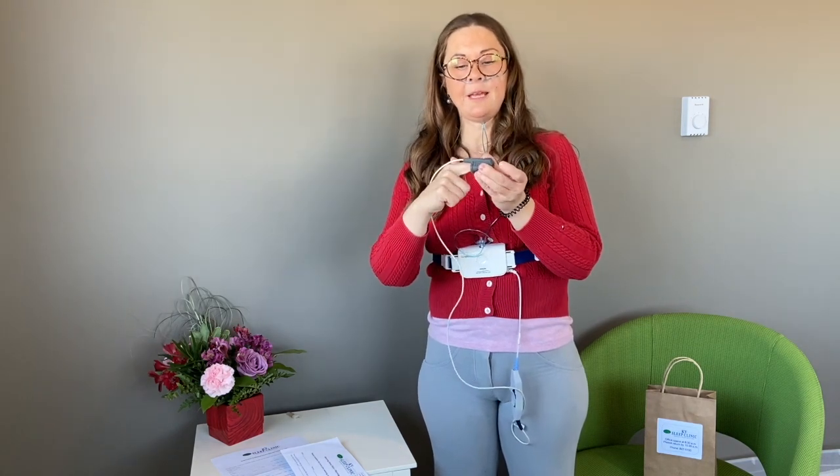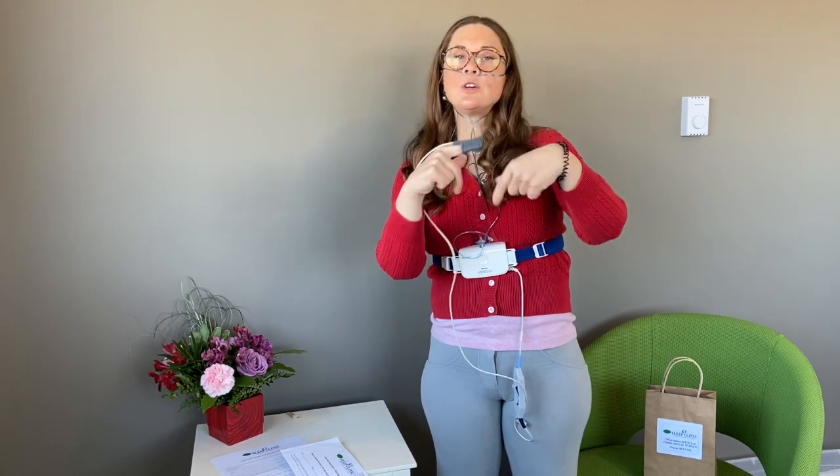The finger probe is going to tell us your oxygen level and your heart rate all night. Put your finger in here — either your pointer or your middle finger on either hand, with the cord on the top. Take some of the tape we've supplied and tape it twice to the top of your finger. Don't wrap it all the way around — you don't want to cut the blood supply off — and tape it to the back of your hand as well. Make sure that's nice and secure; your oxygen level and heart rate are a very important thing that we need to see.